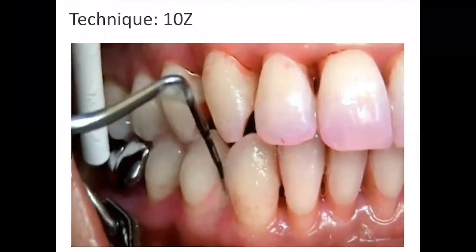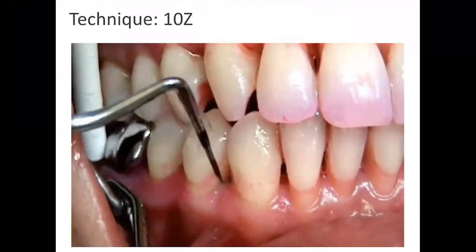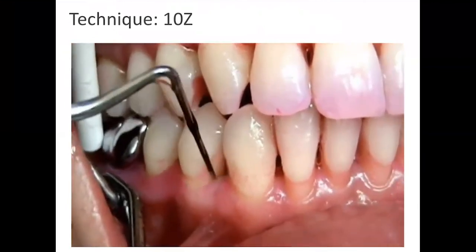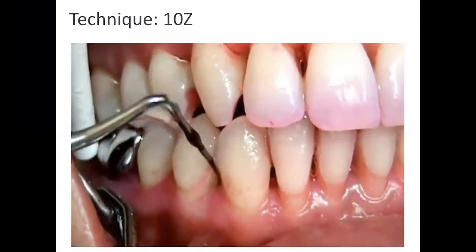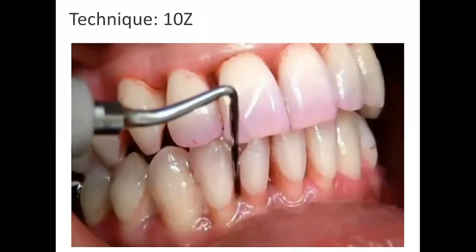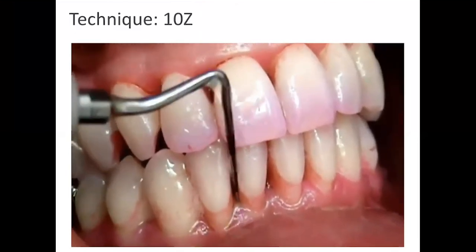Next in your kit is the 10Z. It has periodontal probing markings, so it can be used for patients with higher levels of disease or for patients whose tissue does not easily distend, where the thinness of the tip is excellent for gaining subgingival access.